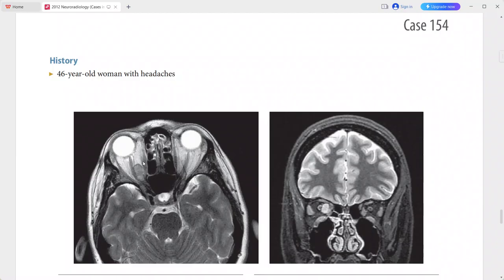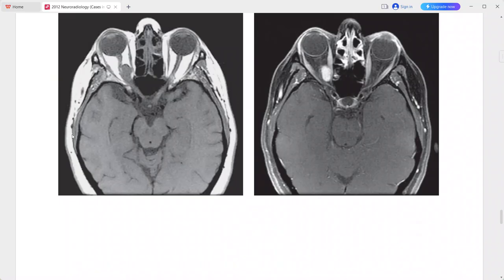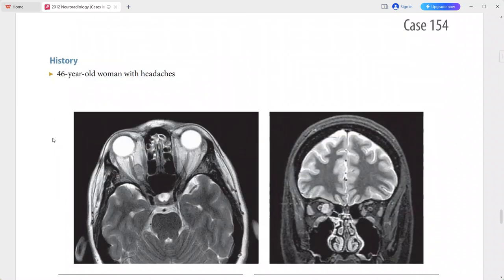On axial T2-weighted MRI, there is a pseudo capsule visible around the anterior half of the lesion. This pseudo capsule appearance is due to chemical shift artifact and is therefore not visible on STIR or fat-suppressed sequences. These imaging features are typical for orbital hemangioma. Differentials include schwannoma, meningioma, lymphoma, metastasis, and venous varices.